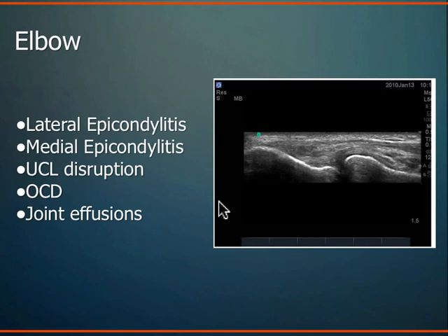So around the elbow, a couple of very common diagnoses, whether it's tennis elbow or golfer's elbow, lateral epicondylitis or medial epicondylitis. There's multiple names for it, but you can image those areas quite well. So this is the distal humerus, humeroradial joint or capitellar radial joint, radial head. And this is the extensor tendon coming in and attaching on the humerus lateral epicondyle here. So superficial, deep bone structure, tendon tissue coming across the joint space and attaching onto the lateral epicondyle.